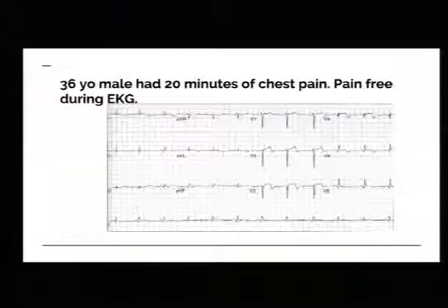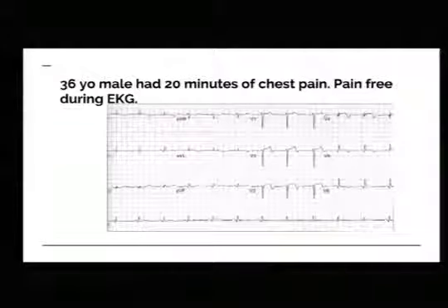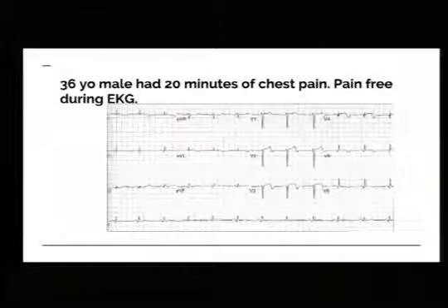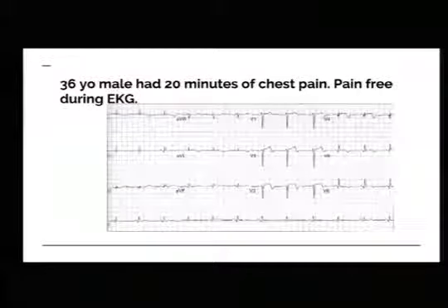So what do you see here? Kind of some little bit of baseline ST elevation here. Definitely not tombstone looking. But look at your T wave. What is that?